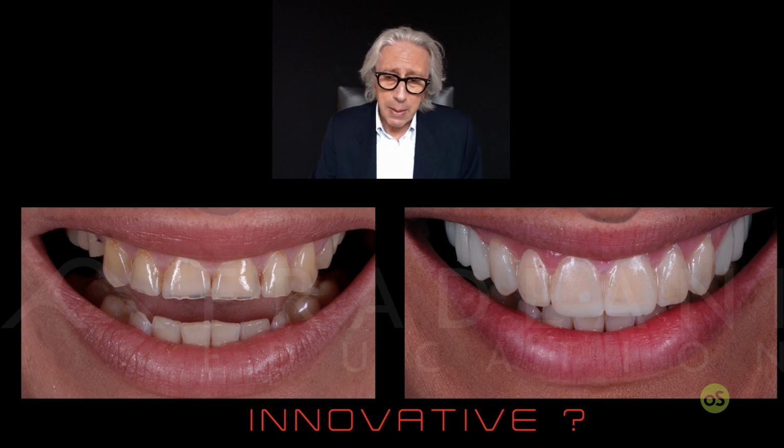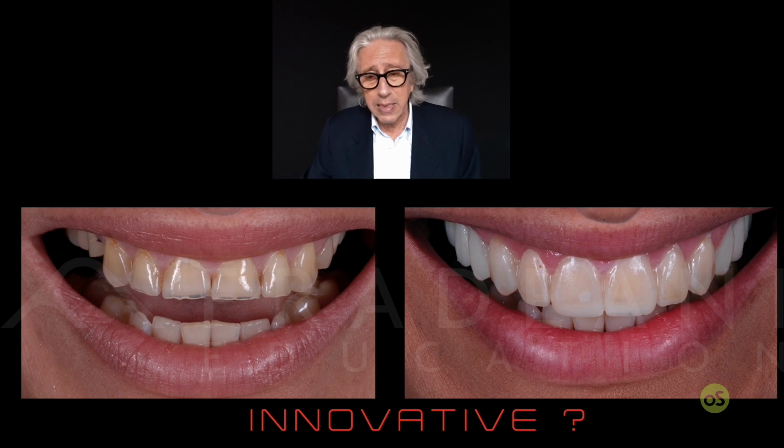But after a while, the patient will readapt to the new position and stay in place in the retruded position, changing this position. Of course, at the beginning, the patient can complain. At the time of delivery of the mock-up, they say, oh, I touch here, it's not going well. And if you don't know exactly that this could happen, you don't anticipate it to the patient, it will be problematic, because the patient has to be informed in advance.